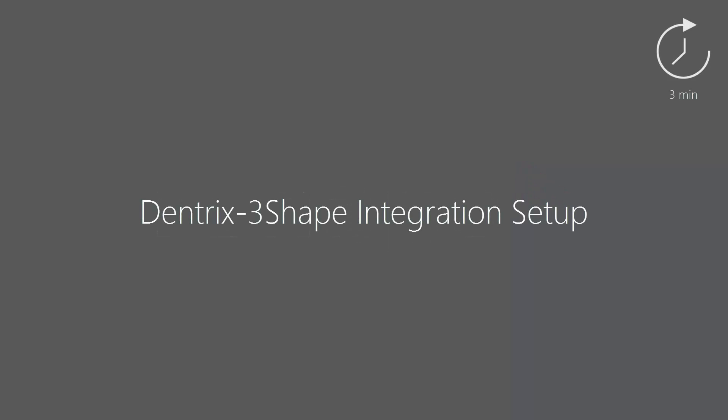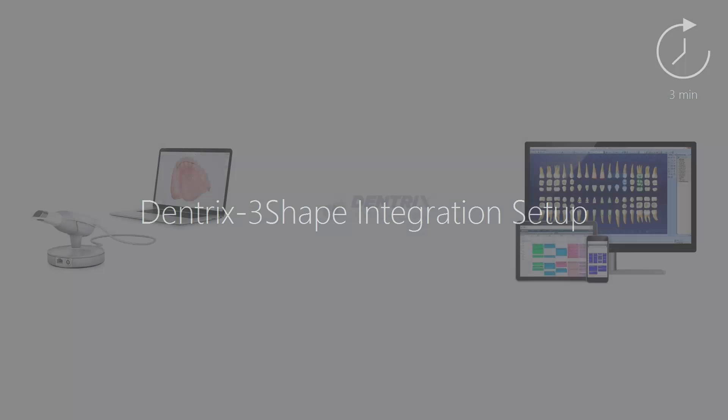The 3Shape Trios digital impression system is now Dentrix connected. With the connection comes a lot of benefits. This video will show you how to set up the registration.